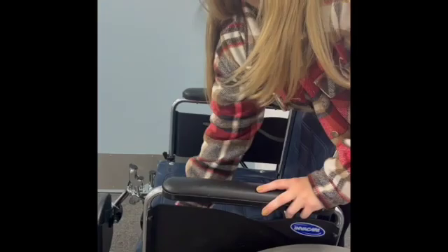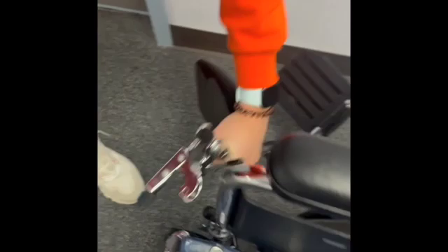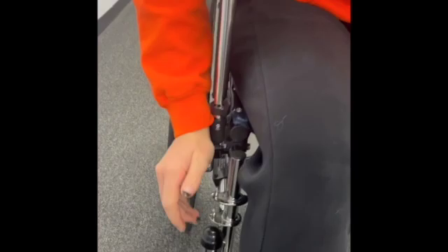To take the legs off, you pull this little silver knob, swing it out, and pop it up. Then I'll lock the wheelchair — I'm the patient, I'll sit in it. This is unlocked and I can wheel all over the place, and then I can lock it and now I can't go anywhere.